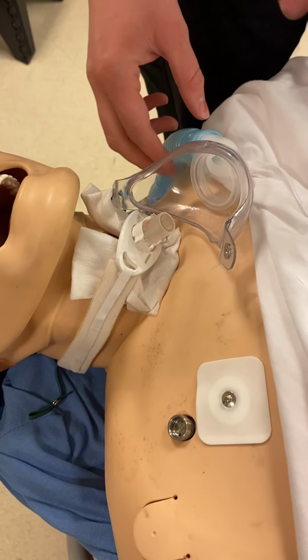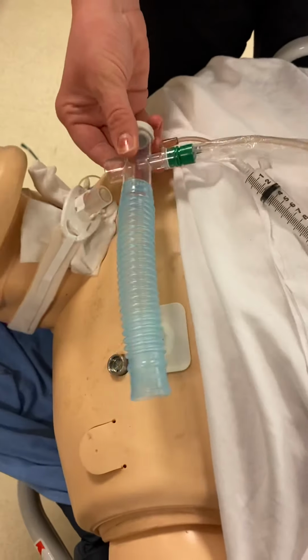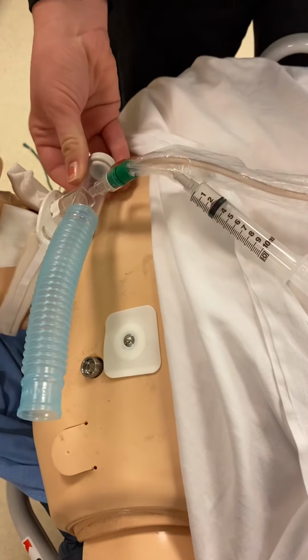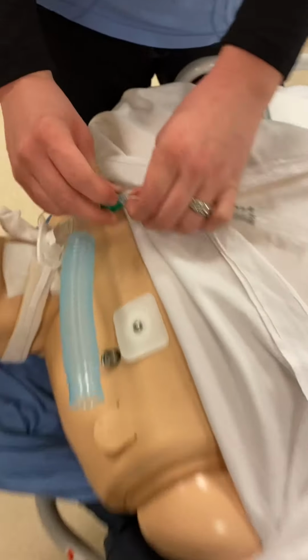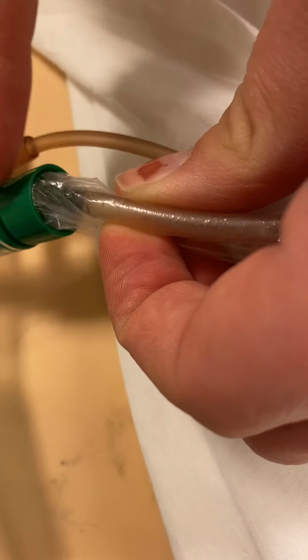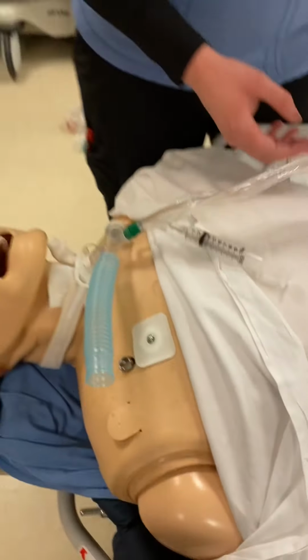I like to then suction the patient. So if you had your inline suction, you're going to just pop that onto their inner cannula. On this tubing, there is a black mark. That always needs to be pulled back past the green so that you're not occluding any part of that patient's airway if this were to stay in place.